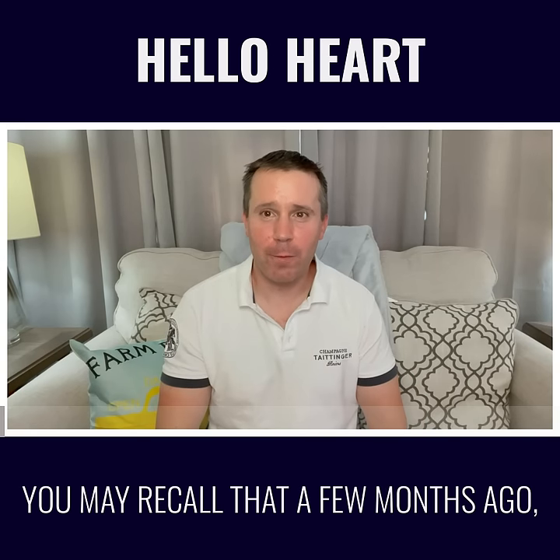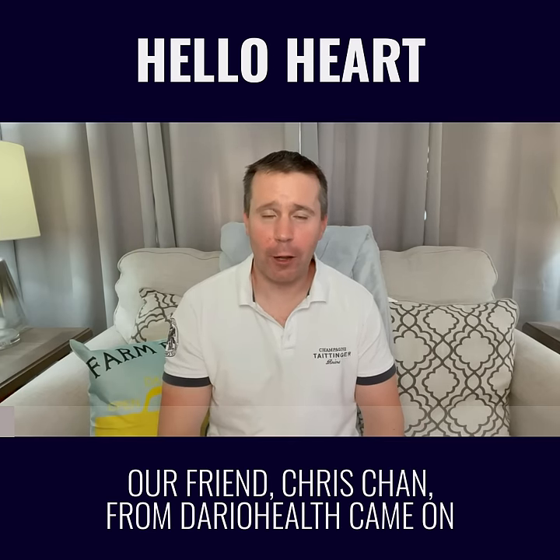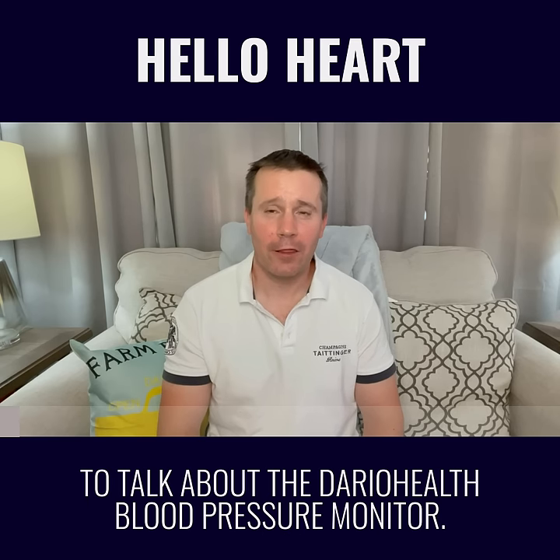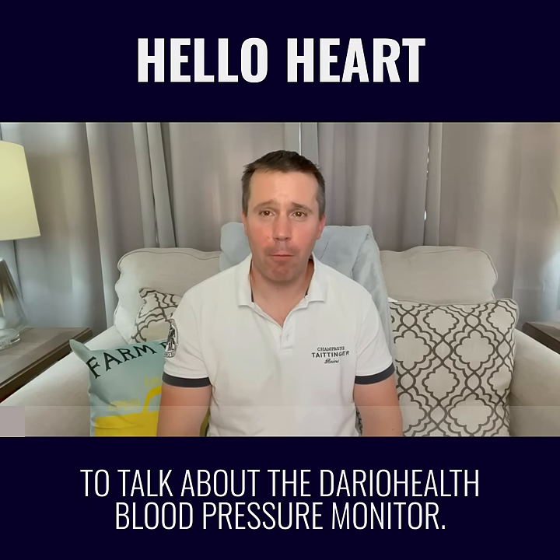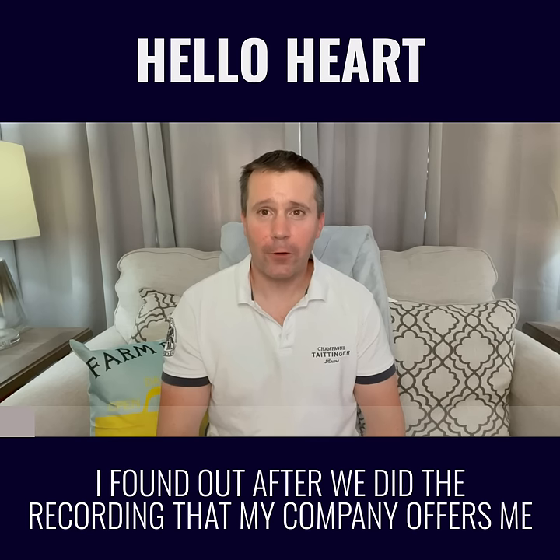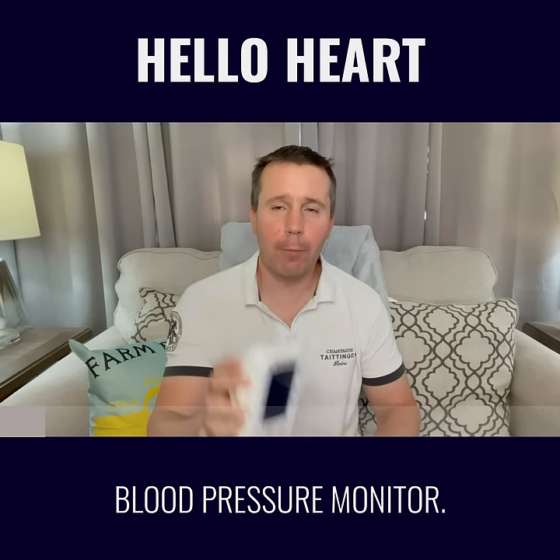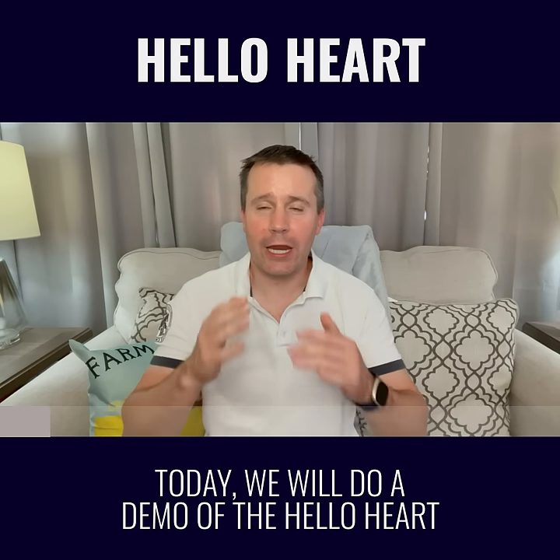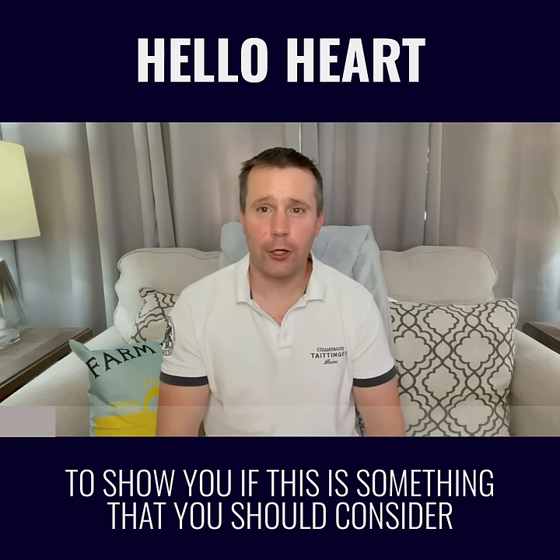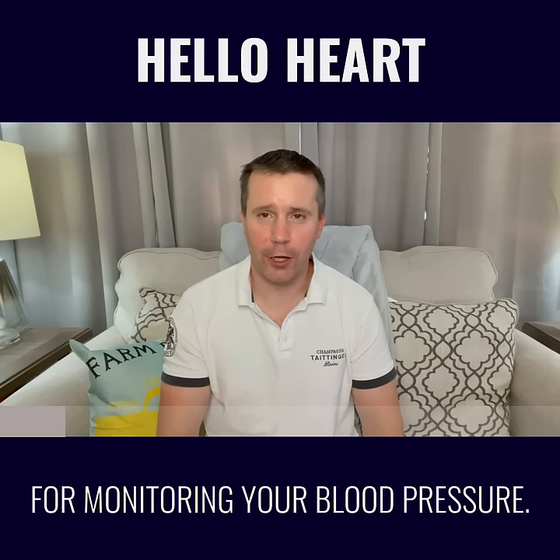Hey everyone, this is John Coleman. You may recall that a few months ago, our friend Chris Chan from Dario Health came on to talk about the Dario Health Blood Pressure Monitor. I found out after we did the recording that my company offers me another option free of charge called the Hello Heart Blood Pressure Monitor. Today we're going to do a demo of the Hello Heart to show you if this is something that you should consider for monitoring your blood pressure.